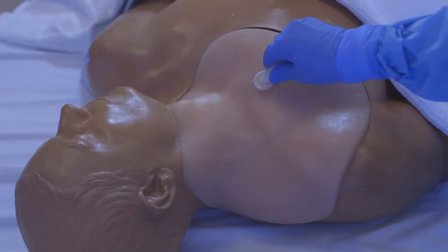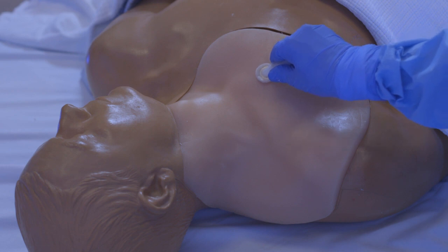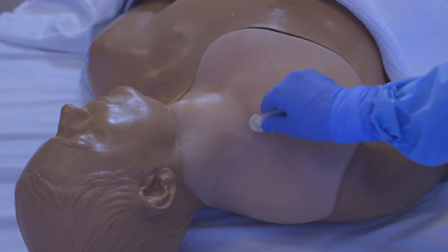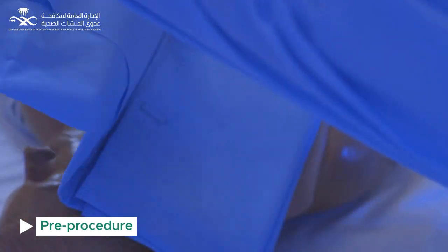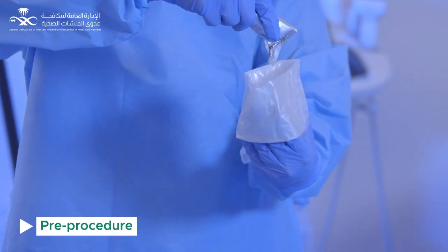For skin preparation, do a back and forth motion using 2% chlorhexidine gluconate with 70% isopropyl alcohol stick for at least 30 seconds. Allow it to dry completely before puncturing the site. Drape the patient from head to toe using sterile technique. Apply a sterile cover to the ultrasound probe with sterile gel to confirm anatomy.